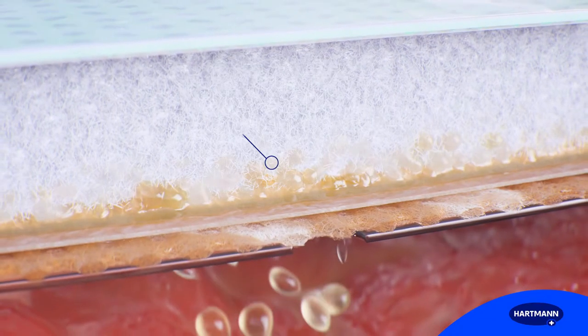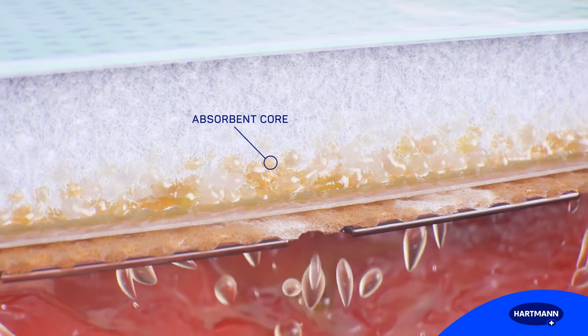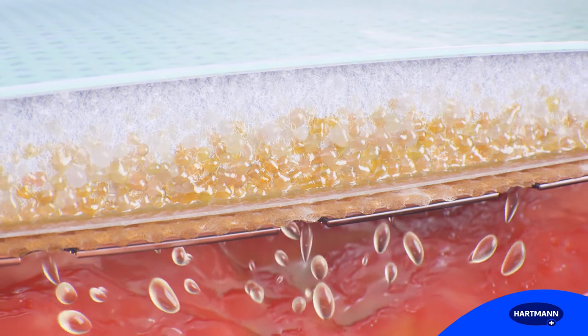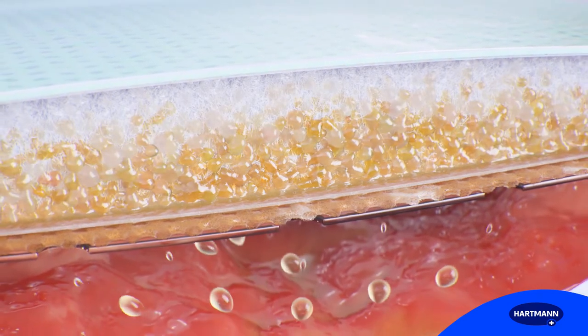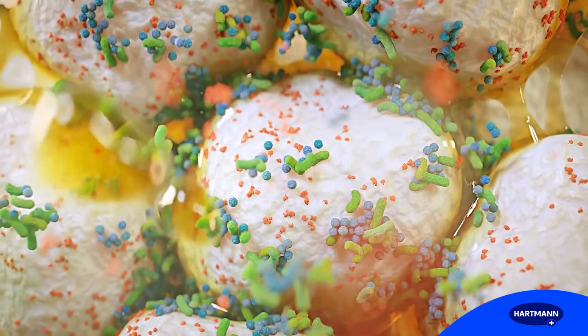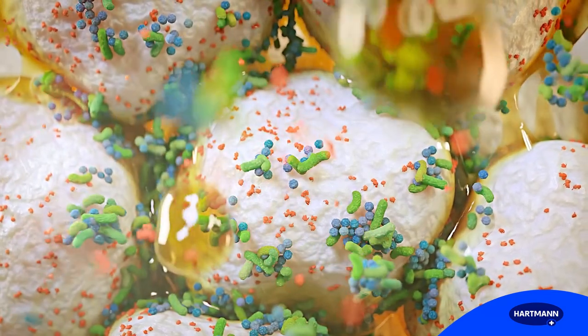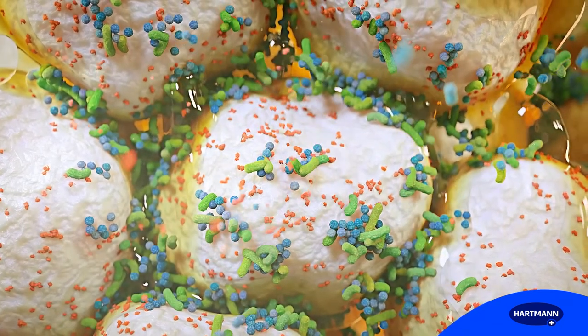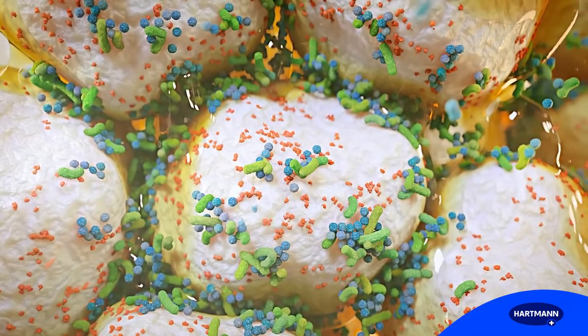The core of Zetuvit Plus Silicone Border consists of a unique combination of cellulose and SAP. It locks absorbed fluid by transforming it into a gel. Inhibitors of wound healing that are contained in the absorbed fluid, like matrix metalloproteinases and bacteria, are bound to the superabsorbent particles inside the core.